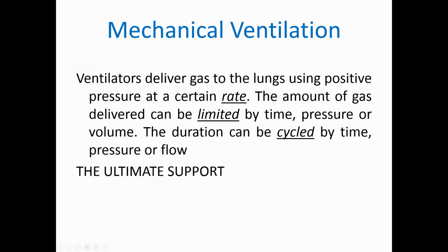Mechanical ventilation delivers gas to the lungs using positive pressure at a certain rate. The amount of gas delivered can be limited by time, pressure, or volume, and the breath can be cycled by time, pressure, or flow. It is really not a treatment. It is just a supportive tool while you treat the underlying condition. If you think about ventilation as a treatment option, fail. It's just a supportive tool.